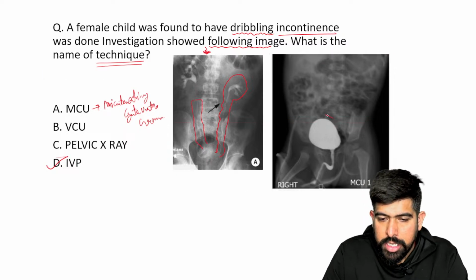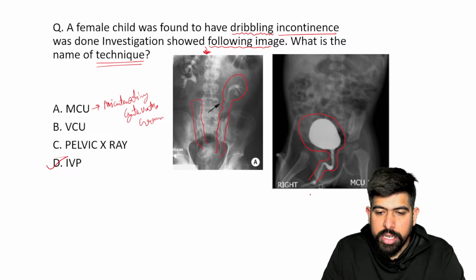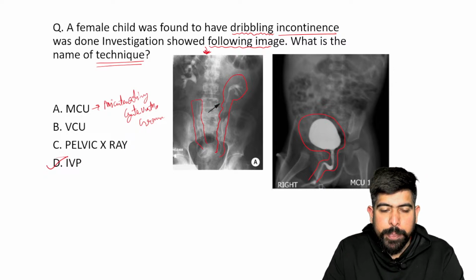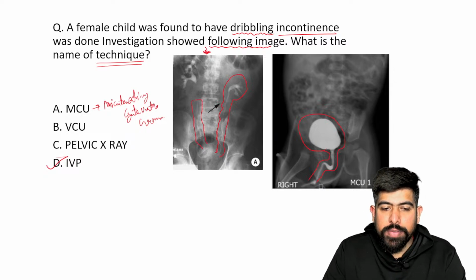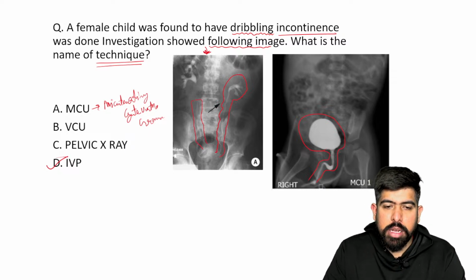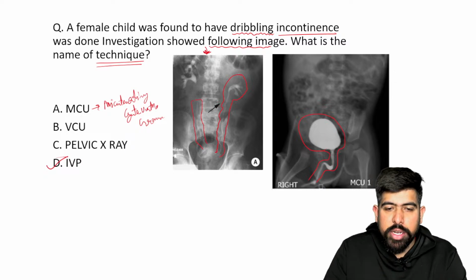So this is the contrast material which we filled inside the bladder, and you can see this contrast material is going out through this catheter that is put there. Or maybe the patient can urinate, right? When the patient is urinating, we are looking at the anatomy of your bladder, mostly anatomical, or maybe some pathologies in the structure of your bladder.